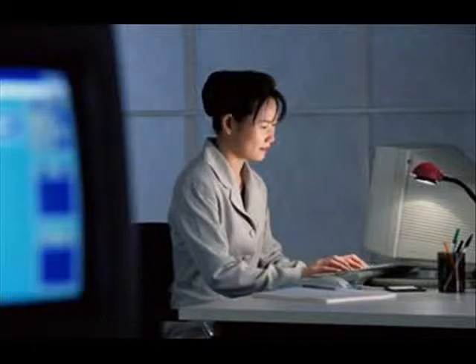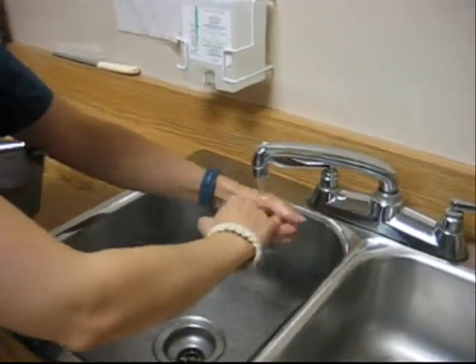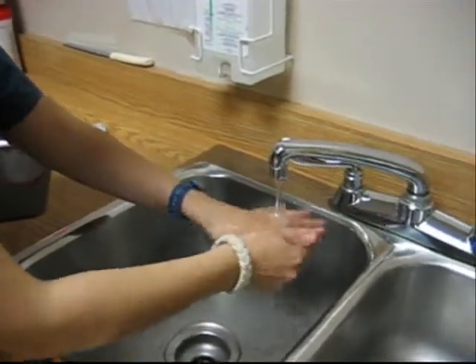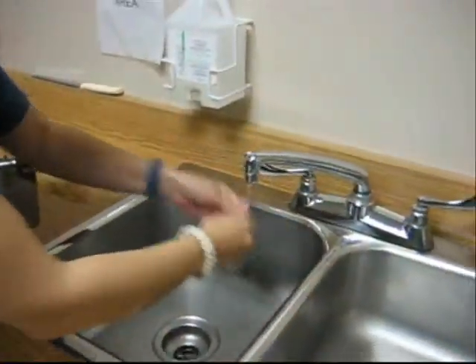Verify, interpret, and evaluate the physician's order if appropriate or where policy and procedure dictate. Use aseptic technique throughout the procedure and thoroughly wash hands at a sink or with an approved alcohol-based product prior to the start of the procedure.